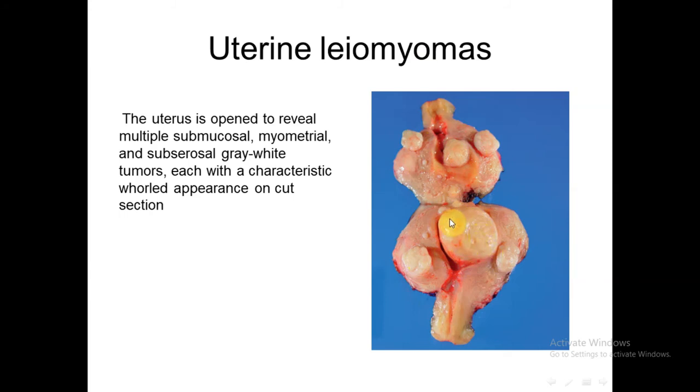They are variable in size, and their location can be either submucosal, intramural, these are intramural leiomyomas, or subserosal location.